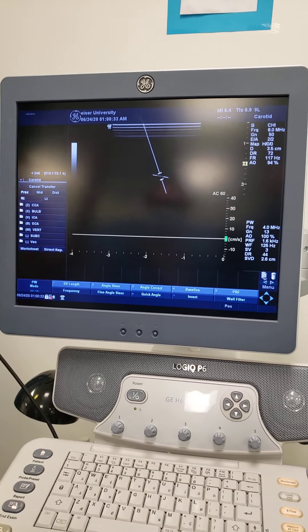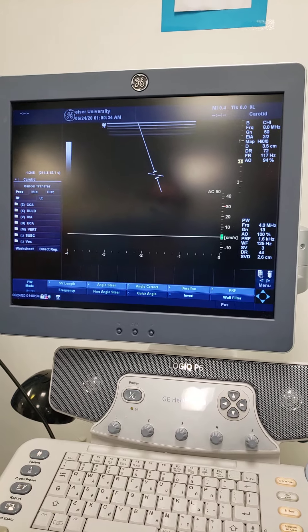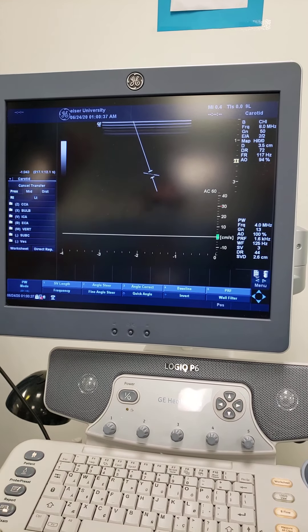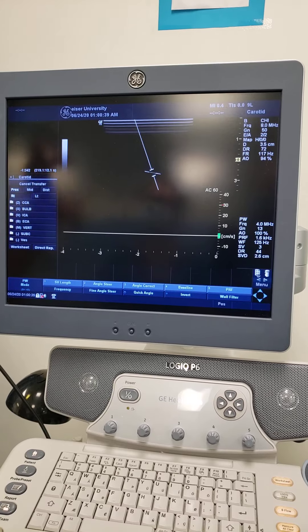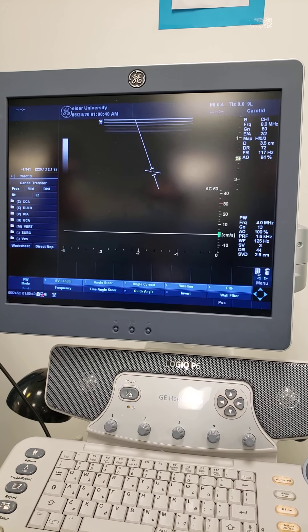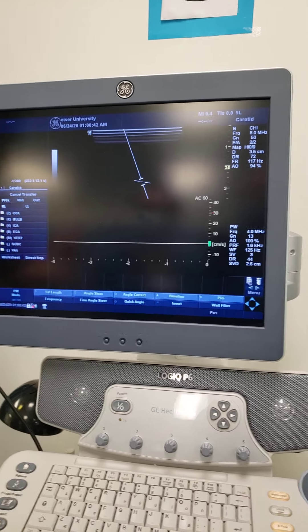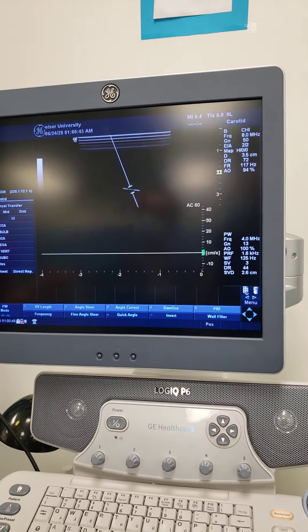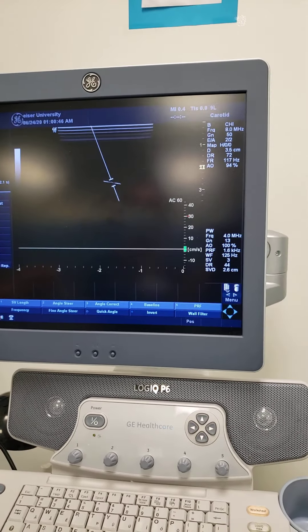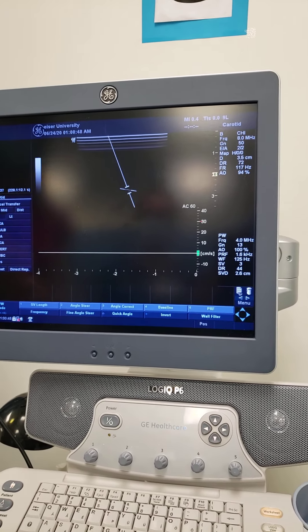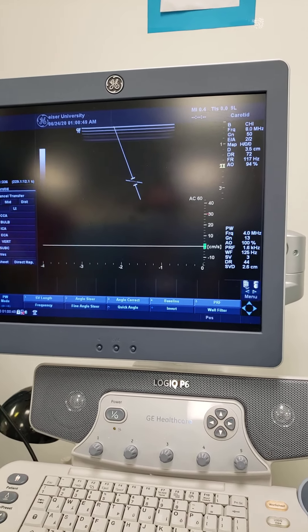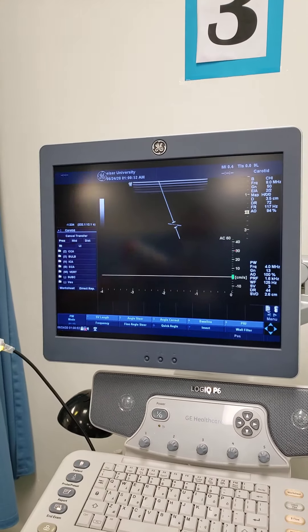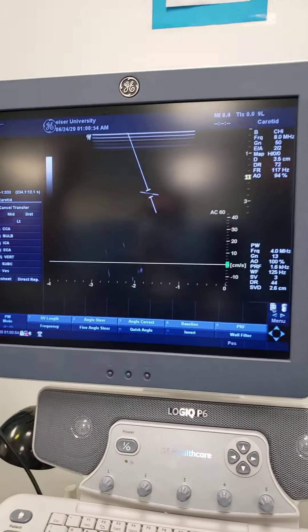So we're close. But instead of eyeballing it, we can get exactly 60 so we know it's lined up. It's like a built-in protractor — it allows us to not have to eyeball the angle. You guys did pretty good, you were at about 55, which is good, but off just a little bit. What would happen if we were off at 55? Well, it would underestimate the velocity — right, because it's changing the cosine. Exactly. Let me add some gel and show you what this looks like with an actual Doppler.